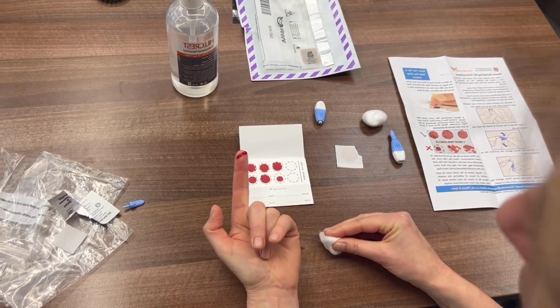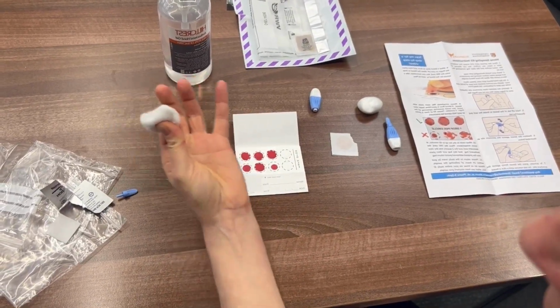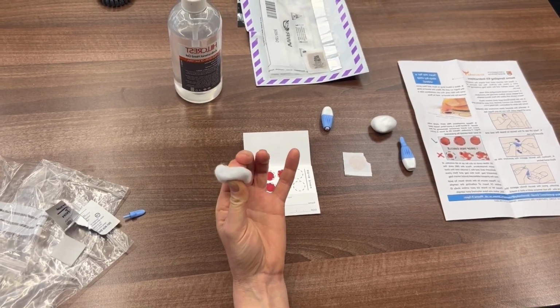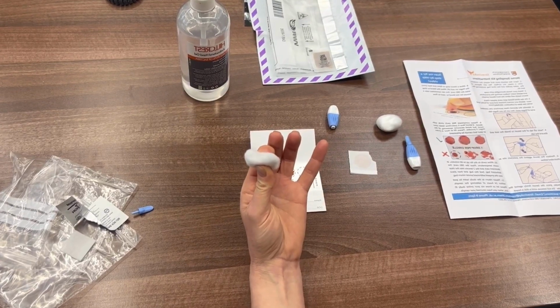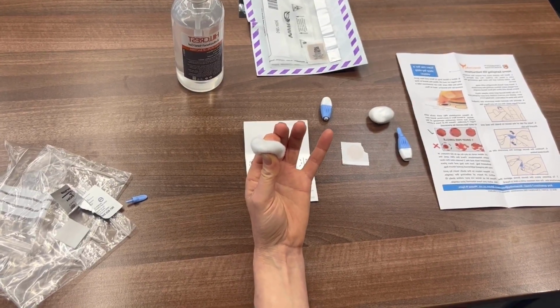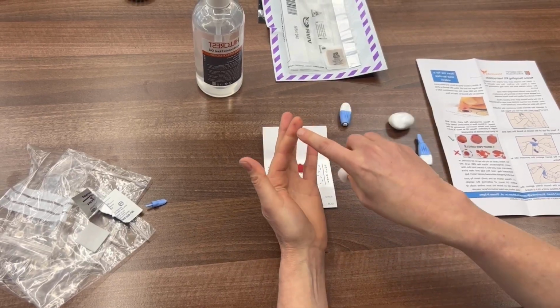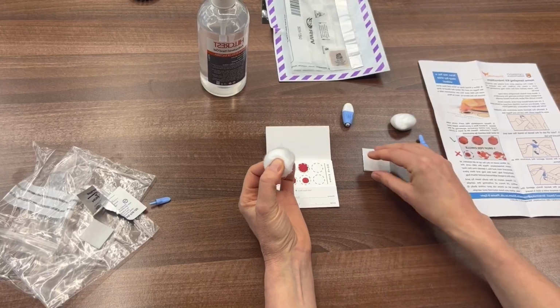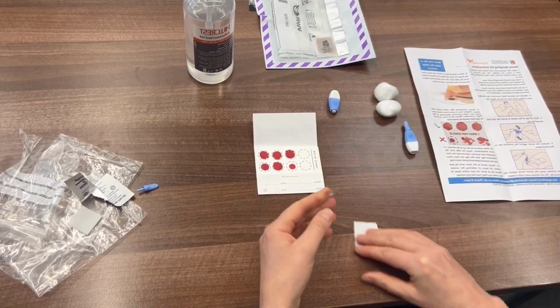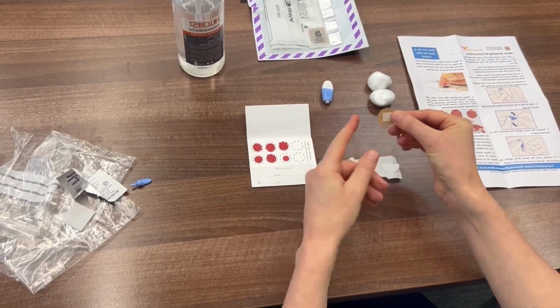What I then do is, you can see by the time you're bleeding well, it does just continue. And so I then squeeze together my finger and where that lancet was for approximately a minute or so to try and stop the blood. Now, it's not that painful, or I don't find it painful to do a dry blood spot test and a capillary prick like that. Some people do find it a little sore, but it is just temporary. And then afterwards, you can get a little bit of bruising around the site, but that settles within a day or so. And then when you've finished with that, you can then just use your plaster to make sure that you keep the area nice and clean.